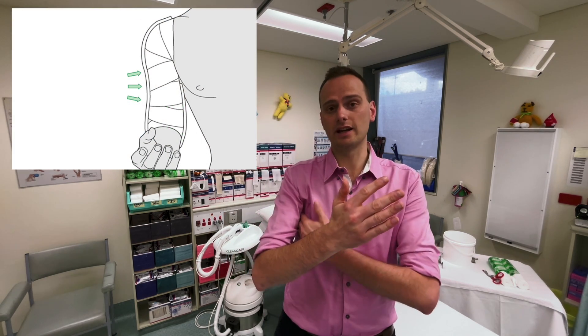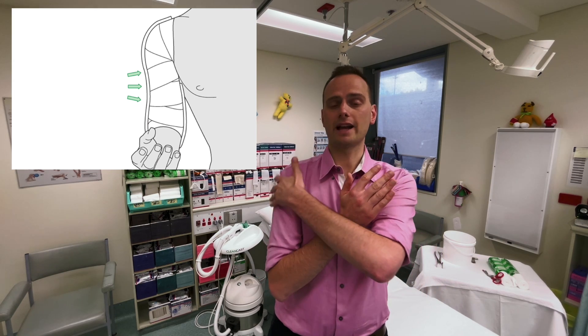The only time we really use plasters for the humerus is for mid-shaft fractures, where we typically use what's called a U-slab or hanging U. This is a U-shaped stirrup that goes from the axilla around the elbow and back up on the outside of the arm. There are technique videos linked below if you want to see how to apply one well.